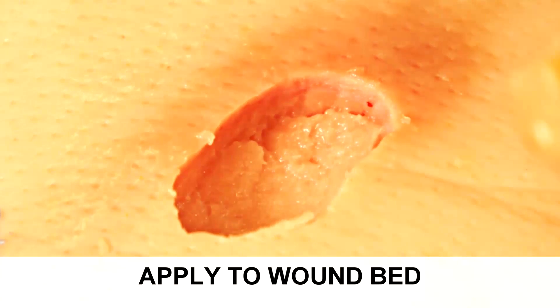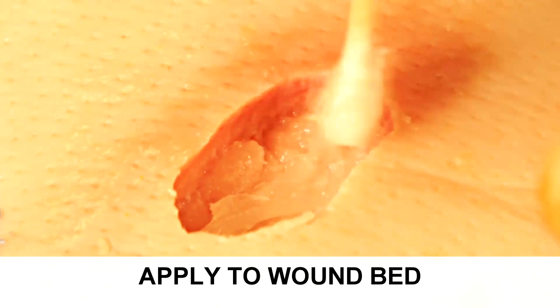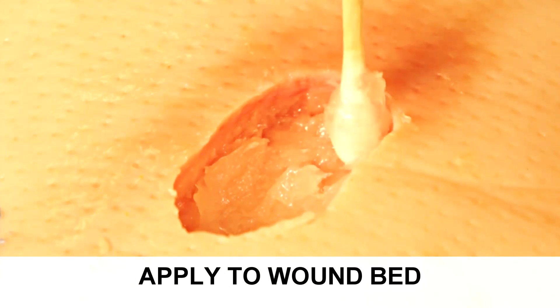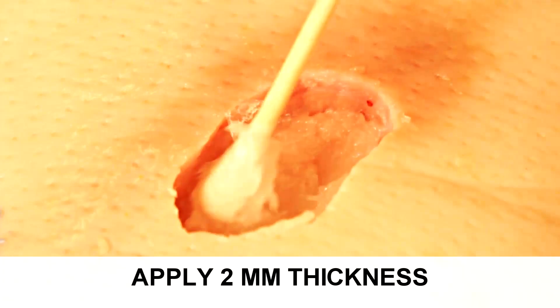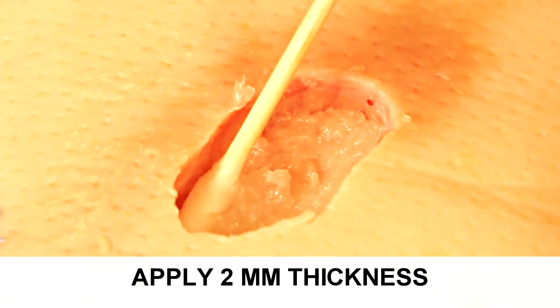Either way, the application is such that you apply it within the wound, trying to avoid the wound edges, and you generally try to provide a uniform coating of approximately two millimeters thick.